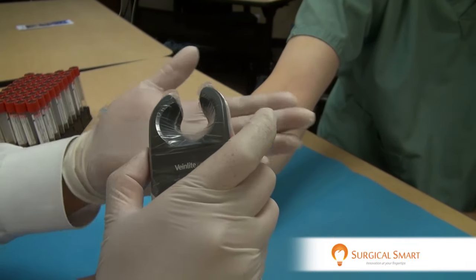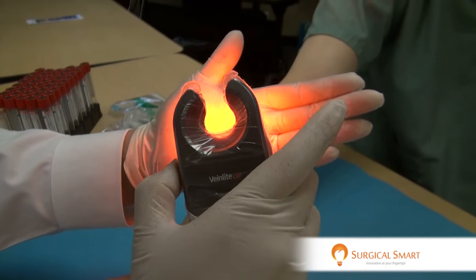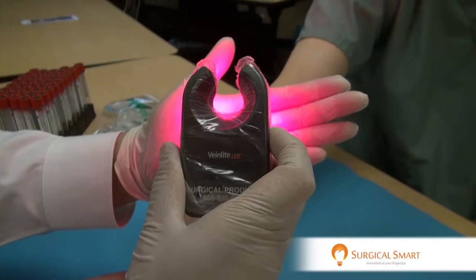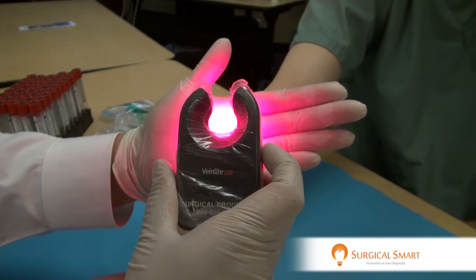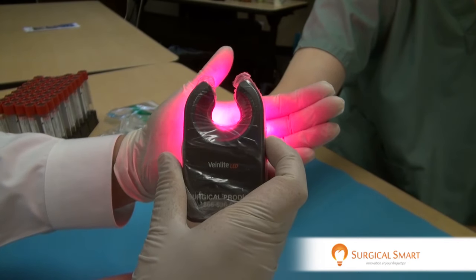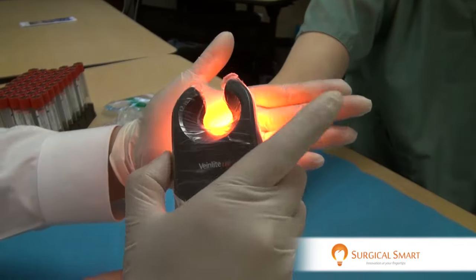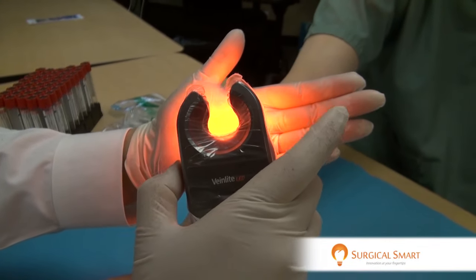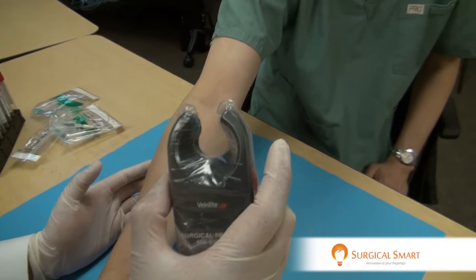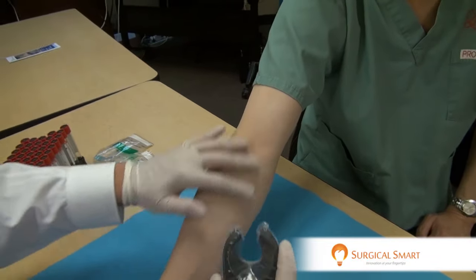The VeinLight actually has two colors — one that's orange and one is red. The red color is actually used to detect veins for individuals who have darker skin or for individuals who have veins that are not superficial, quite deep inside the tissue. The yellow VeinLight is actually more designed to detect superficial veins and it's especially practical for someone who is fair skin.